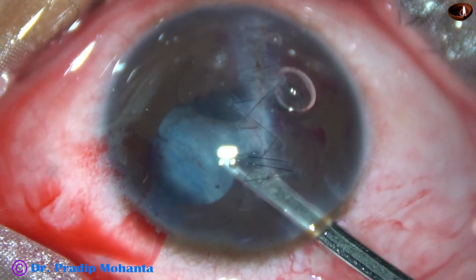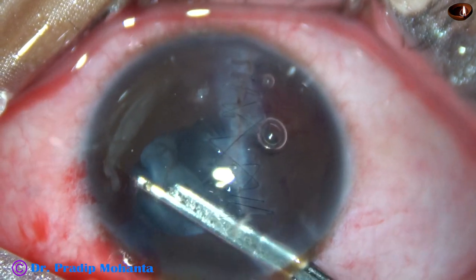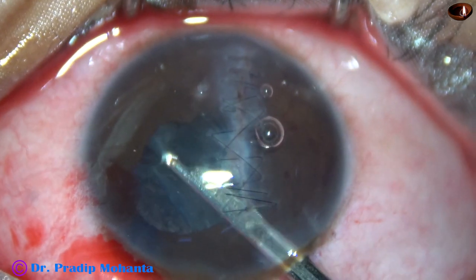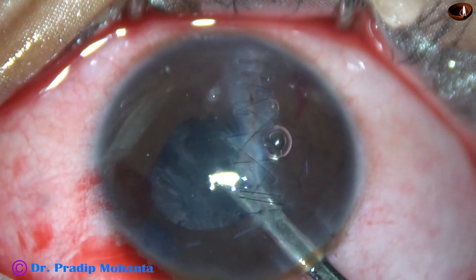Now I take a Simcoe cannula — 23-gauge Simcoe — and aspirate the cortex. In three weeks, most of the cortex had already liquefied and been absorbed, so very little cortex remained.